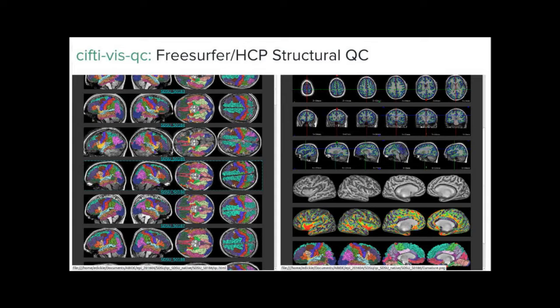I've been building these formats, which basically recreate some of the FreeSurfer QC pages you've seen in the past. But some of the things I added, which I wanted for QC and which don't exist in other packages, are these all-subject index page views, which I find really useful. For every view I create a subject page view, which is what we're all used to when doing manual quality assurance: clicking on every subject, deciding whether that subject is good, and then moving to the next subject.